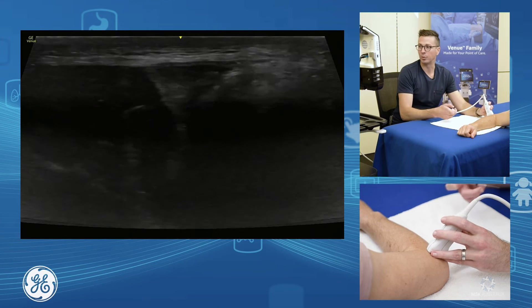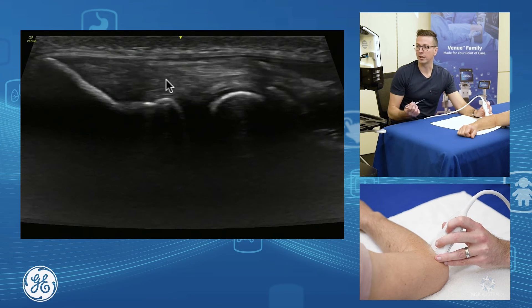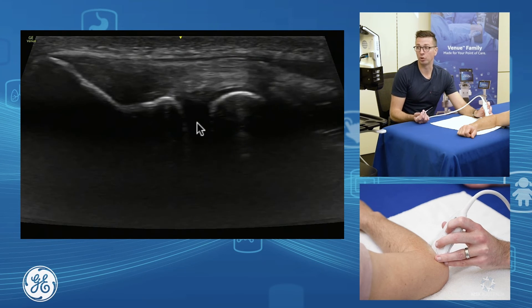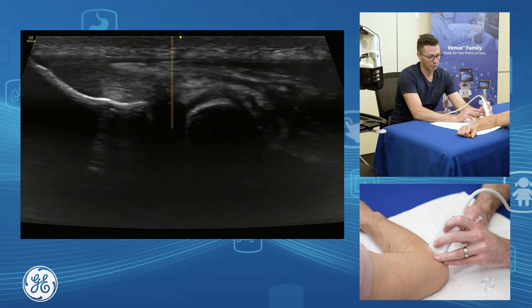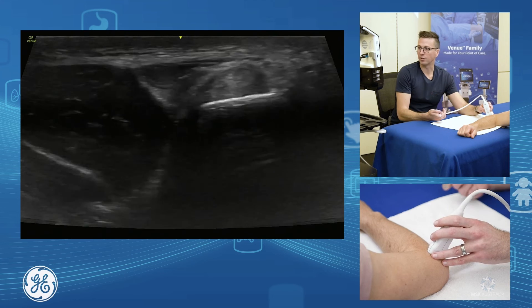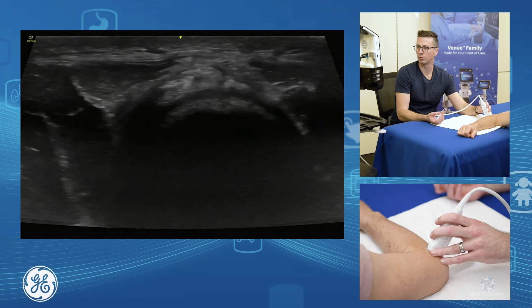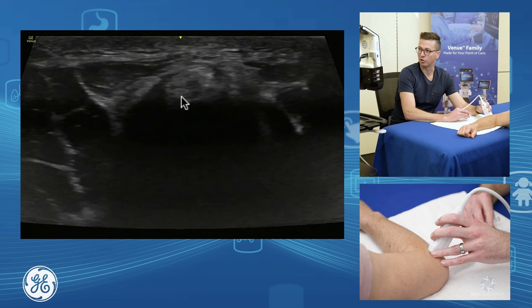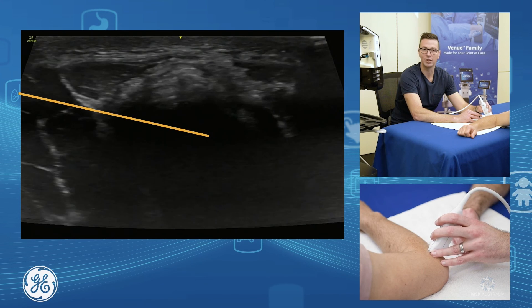This approach also gives us a really nice way to inject our elbow joint as well. Down in through here we have our humerus and our radial head. Underneath the radial collateral ligament is our elbow joint. You can either go in short axis and drop your needle straight in, down into the joint, or you can go in long axis as well. From humerus to radius, the joint sits in the middle — similar to our AC joint injections — and you pop your needle down and inject into your elbow joint with ease.